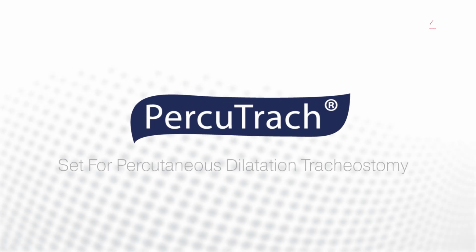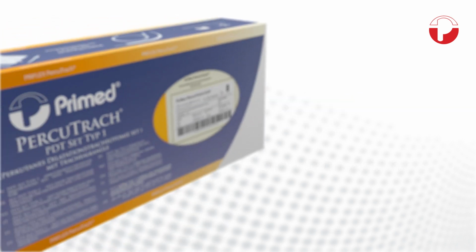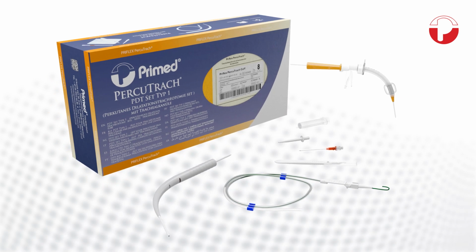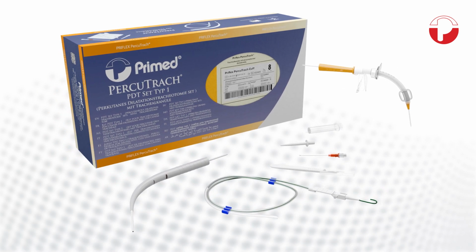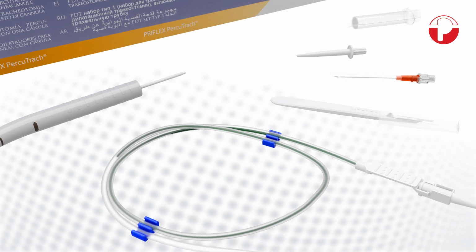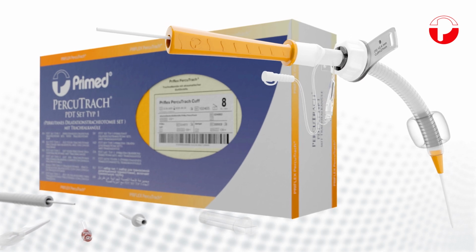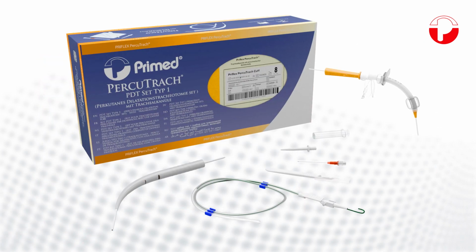PercuTrach, set for percutaneous dilatation tracheostomy. In intensive care, percutaneous dilatation tracheostomy is an established standard procedure. During longer-term ventilation of intensive care patients in particular, it is increasingly preferred over traditional intubation. There are good reasons for this.